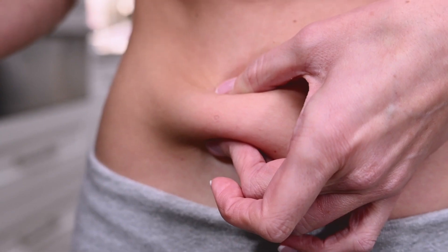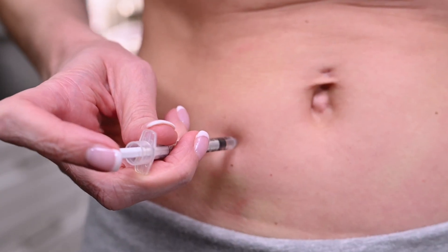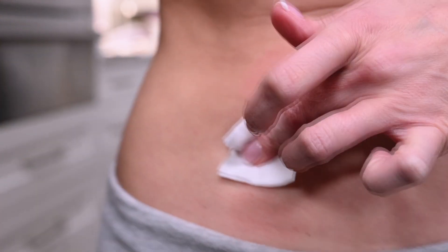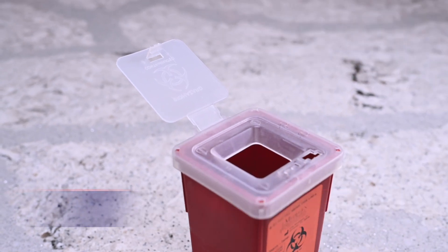You may choose to alternate injection sites as needed. Hold the syringe in your preferred hand. Pinch a fold of skin between your fingers and insert the needle at a slight angle. Release the skin after the full length of the needle is inserted. Push the plunger until all the medication is administered into the injection site. Gently remove the syringe and apply pressure with gauze. Dispose of the used syringe into the designated sharps container.